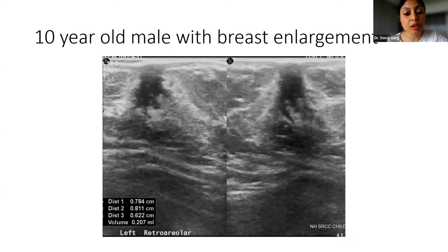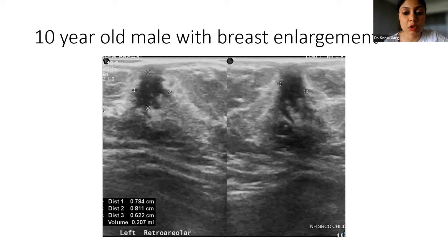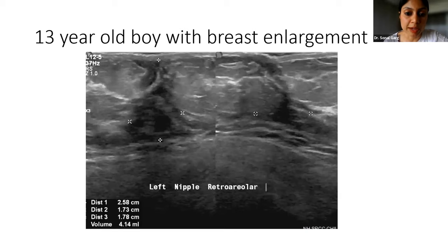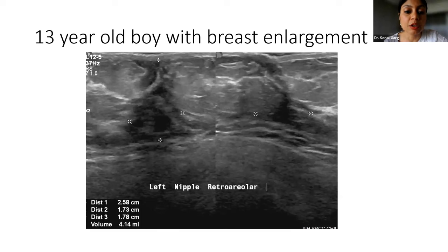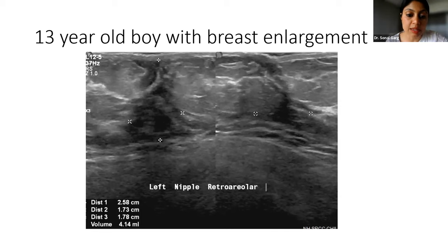In a 10-year-old male it is normal, associated with puberty. You take three dimensions of this nodule and measure it. This is the typical nodular pattern of gynecomastia. Now this is a 13-year-old boy with breast enlargement, and here you can see branching tissue beneath the nipple areola complex — this is the typical dendritic pattern of gynecomastia.